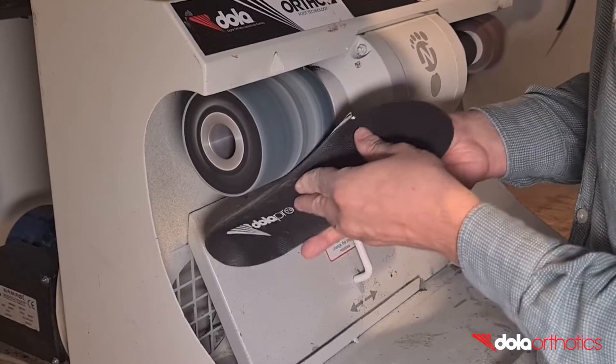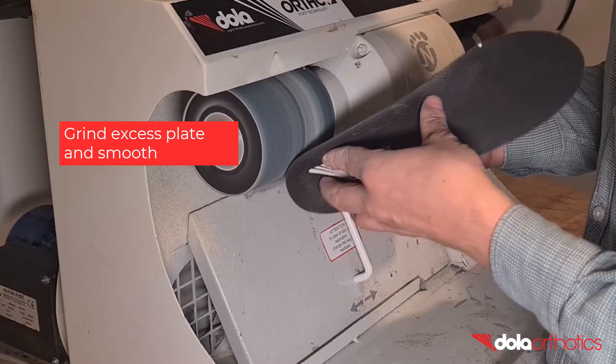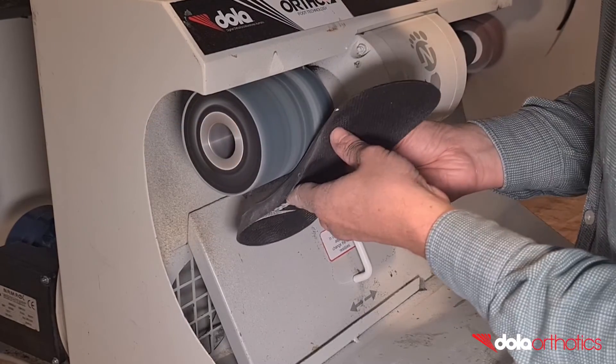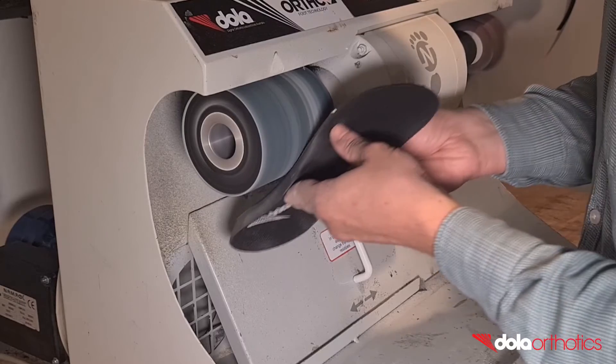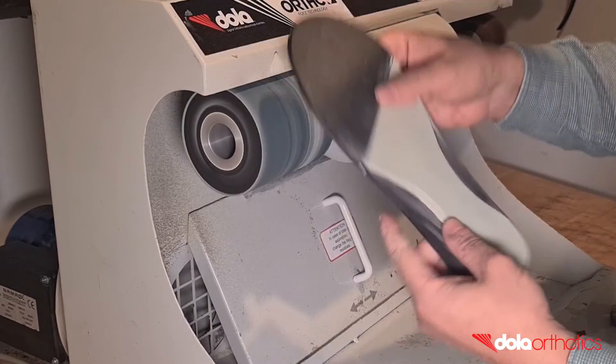Once dry, complete a finishing grind of the lateral, posterior and medial borders and taper to follow the plantar surface. Grind small sections at a time until you become comfortable, and finish with a continuous grind for a smooth finish, or use sandpaper.